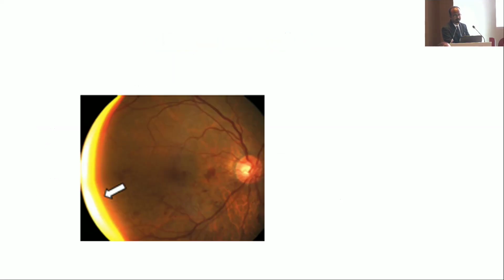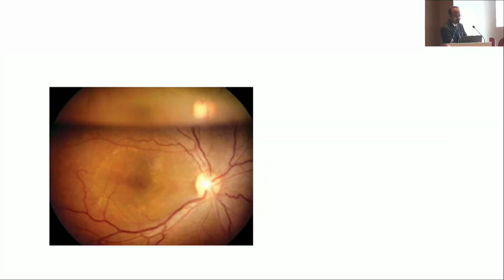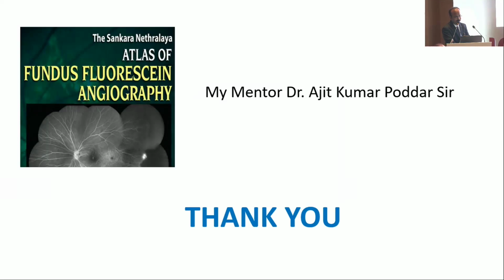If some of the students can identify this. Quiz. It decides your attendance today. Yes, sorry. Yes. So this is an artifact called the yellow crescent, which occurs due to improper alignment between the camera image capturing and the patient, and this is due to the bright flashlight. Yes, thank you. Thank you, Shankar.